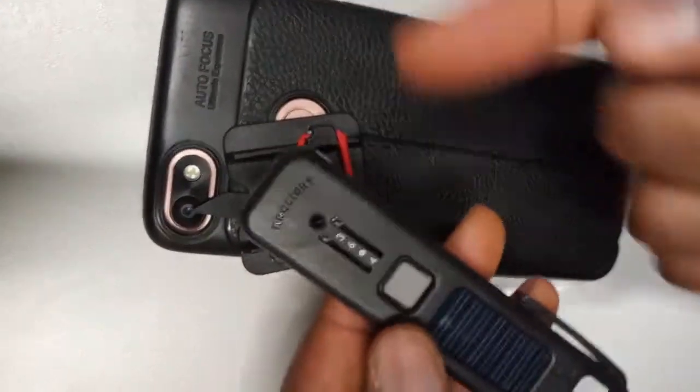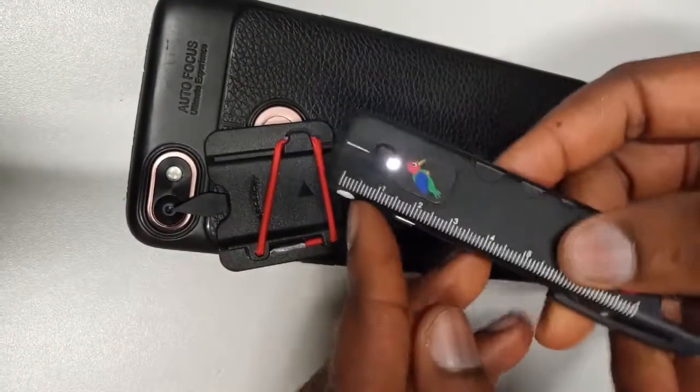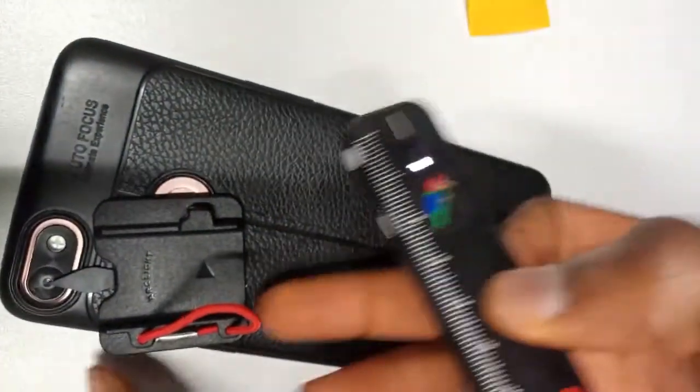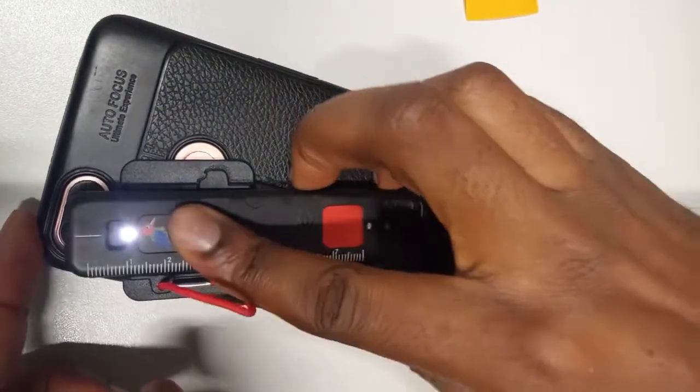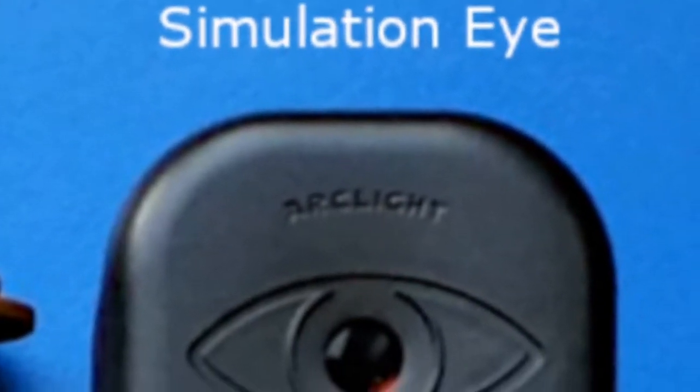For fundus imaging, you use the ophthalmoscope. You attach your ophthalmoscope, click the light once to the dimmest light — which is the first light — and place it such that this part touches here. You put it like this, push it up, and hold it. Then go directly to your phone camera. So you can get a view of the fundus. The more dilated the pupil, the more of the view you get.